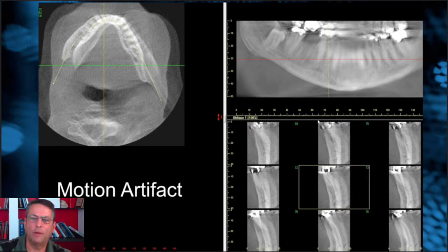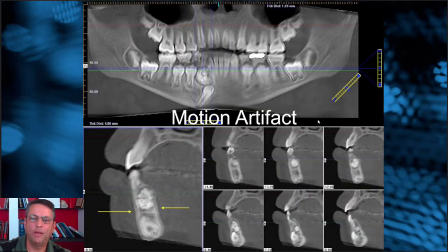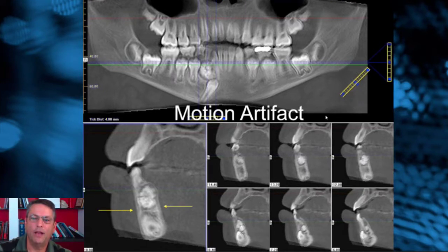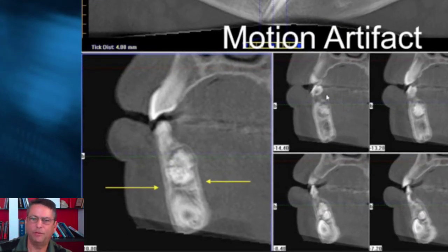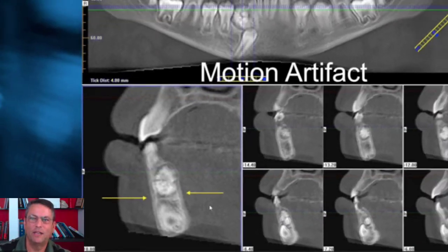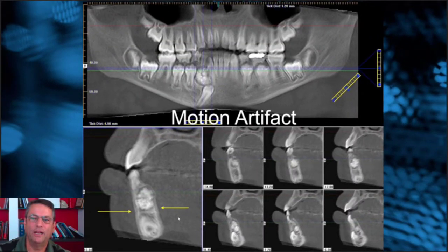We talked about patient motion artifact, and in this kind of case it's very easy to see that the quality is unacceptable. But sometimes we have little nuances where the patient just moves a little bit. As you can see in this particular image, there's a double border, and this cluster odontome — we can't be sure what this is. It's double imaged just slightly, so there's a slight patient motion artifact that has degraded the quality and made diagnostics difficult.